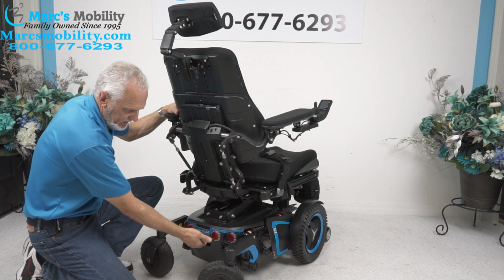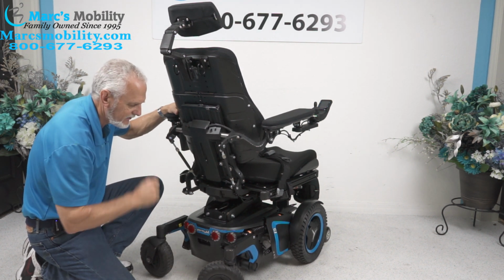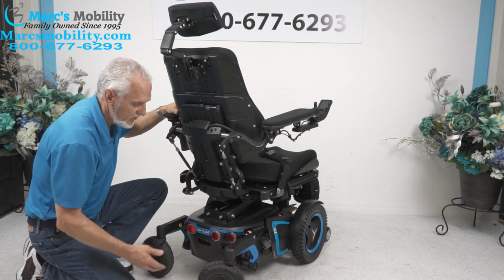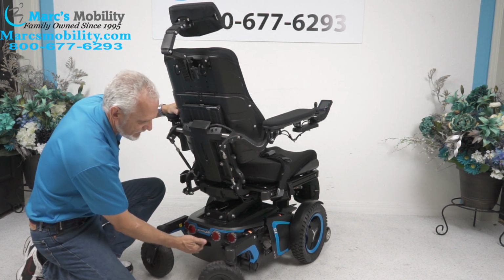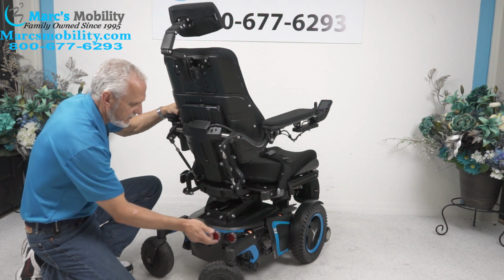This is your power button. When we ship these chairs, we always turn the power off. So the first thing you're going to have to do when you get your chair is go in here and flip the switch. The button is up, so I'm going to turn it back on. Power is back on. These are only reflectors. I get a lot of calls on these. How come they don't light up?